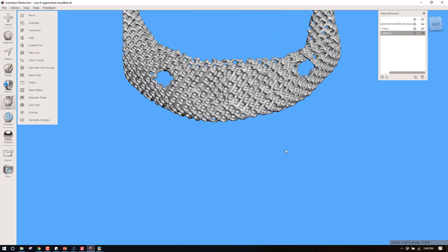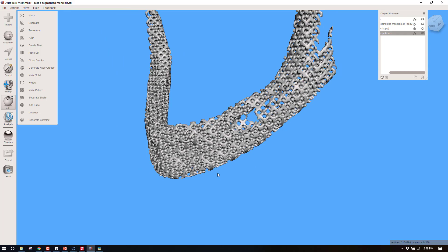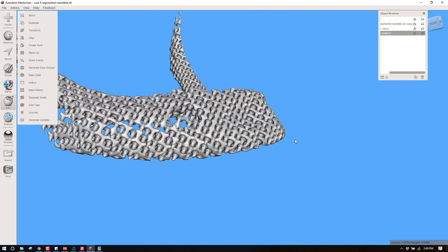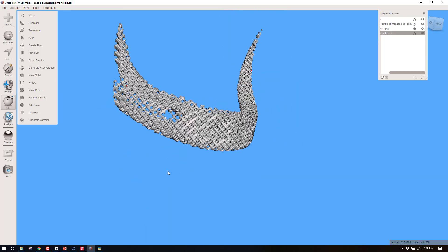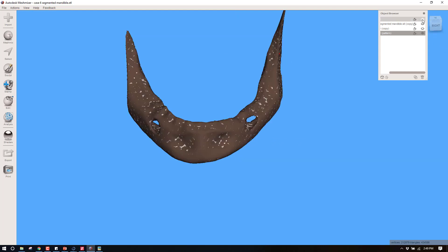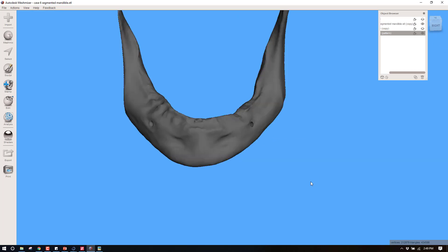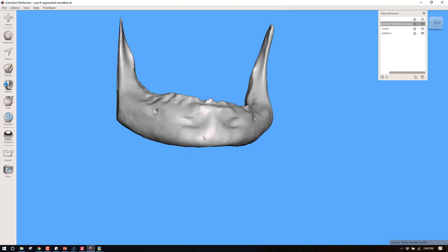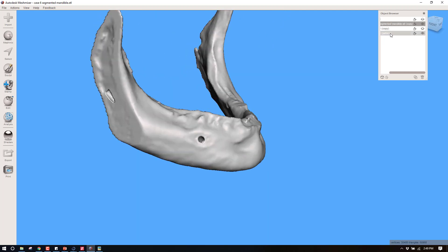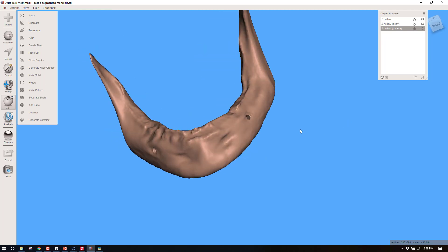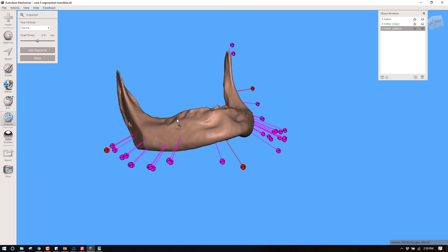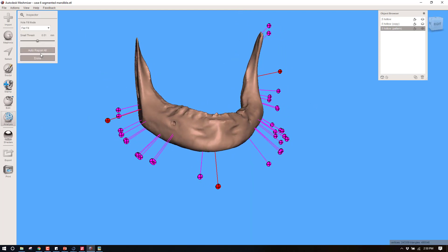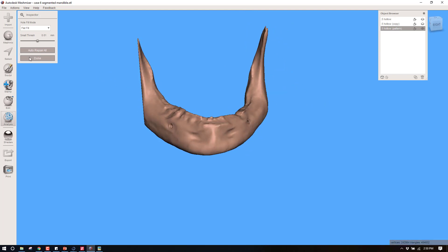That step does take a little while so let your computer think, and if you've got a computer that's borderline on its specs it might crash and not be able to do it. But now I have a cancellous interior, and if I go back up and turn on the hollowed model up here, now we can simply combine these. Control-select and now I can combine. The net effect... let's do one more thing: Analysis, Inspector. You're going to have inevitably some little problems with your mesh, just auto-repair all of them. You might still have one or two it can't repair, but in this case it looks like it did all of them.